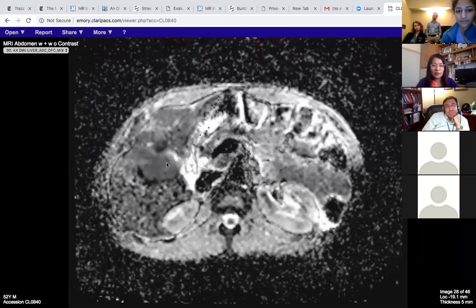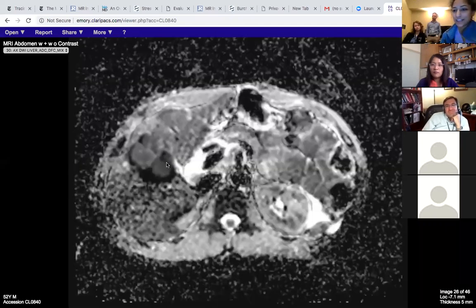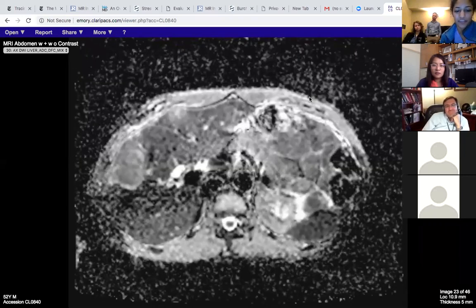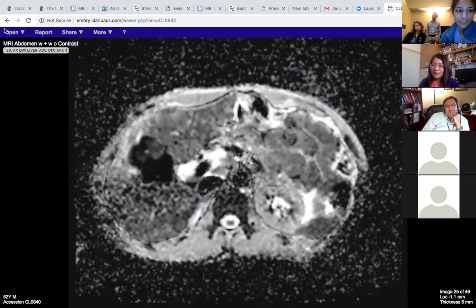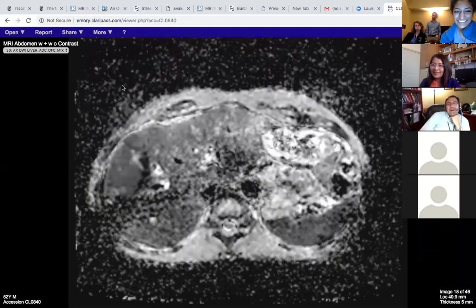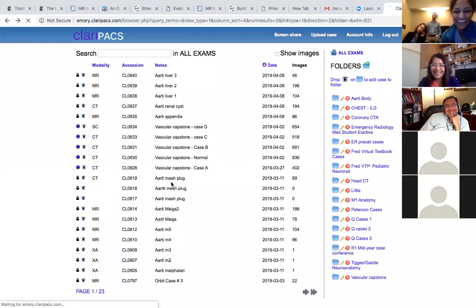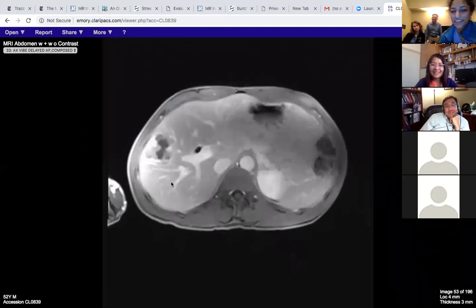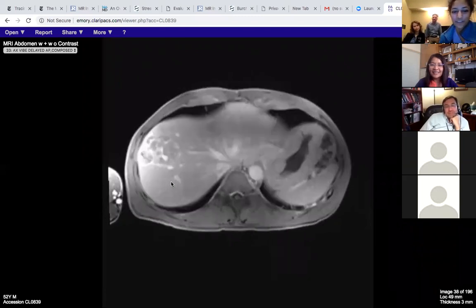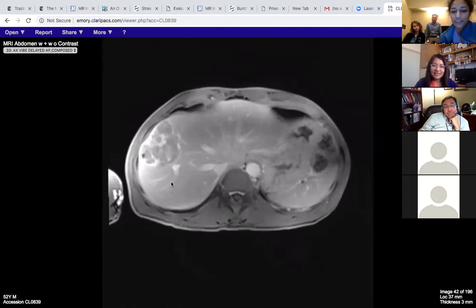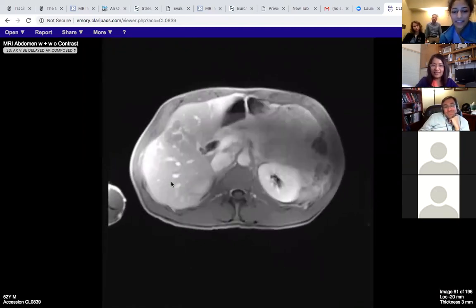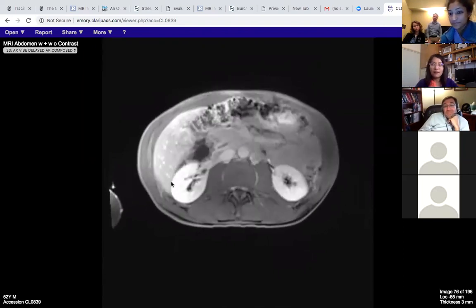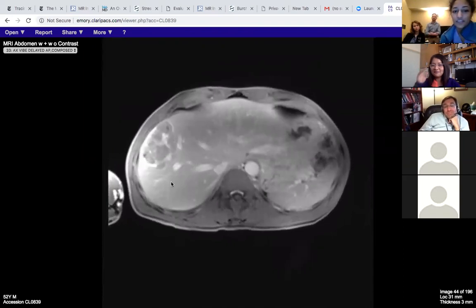Restricted diffusion would make you think abscess. This is basically a retrospective diagnosis, but I think once we familiarize ourselves with this we can think about it prospectively. We thought it could be some kind of indolent infection or abscess, which fits with HIV. The CD4 count was 34 — he hasn't been treated, so he essentially has AIDS. We biopsied this and it came back lymphoma.